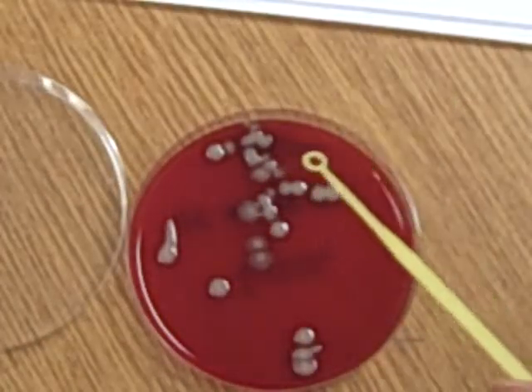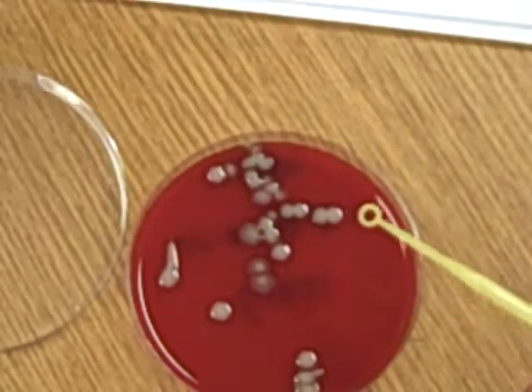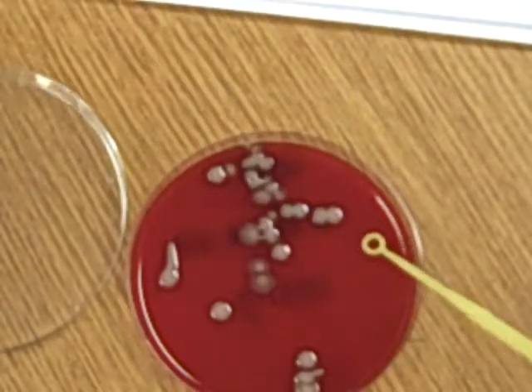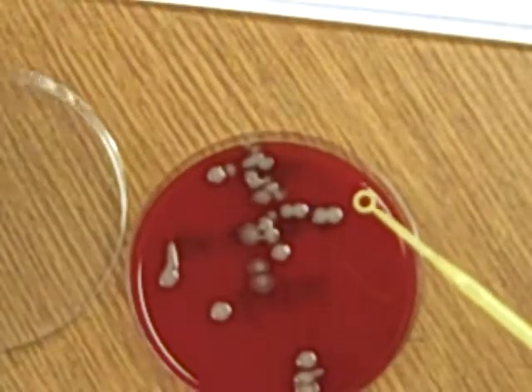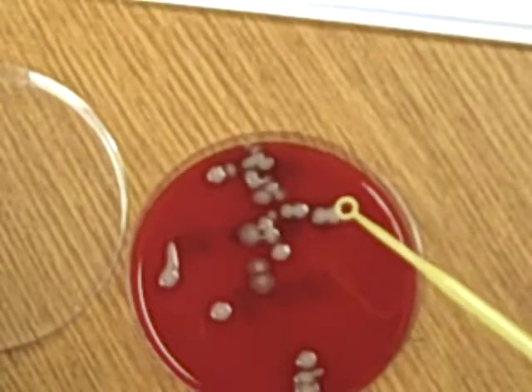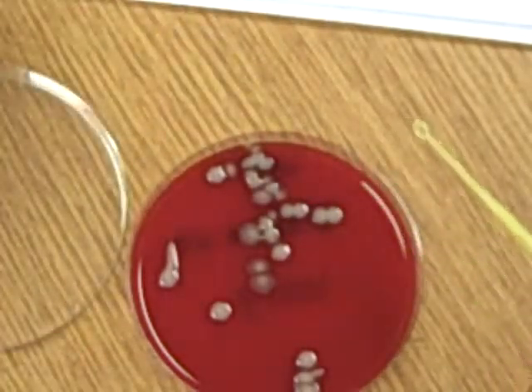However, it's not so simple. If we were to report out a result to the doctor like, hey, there were 6 colony forming units in every 10 microliters of urine, it doesn't mean a whole lot. So what we do is we try to correct for that and report out to the doctor the number of colony forming units per milliliter.